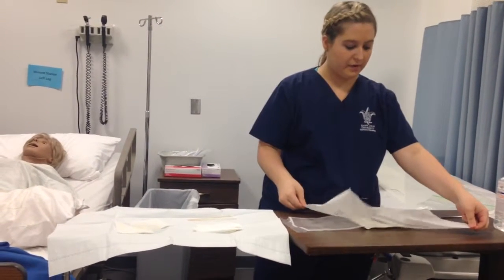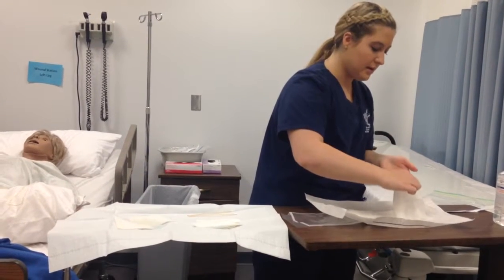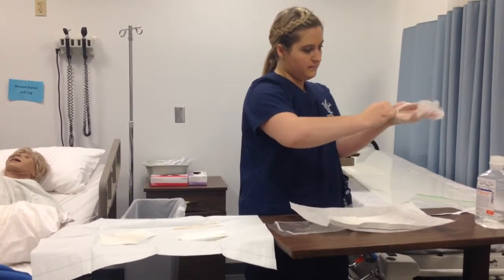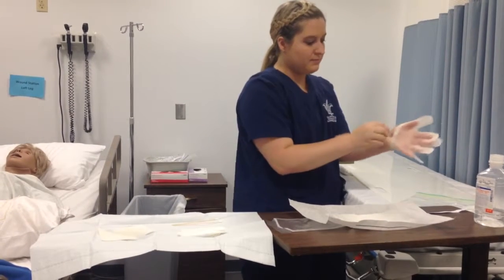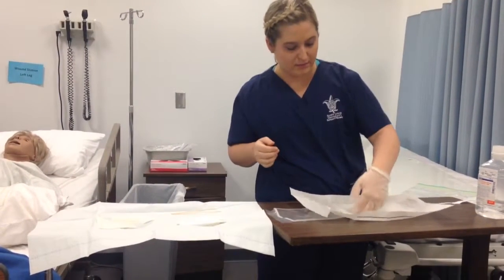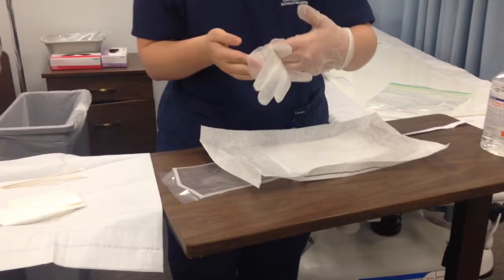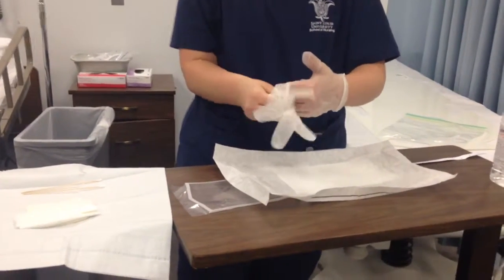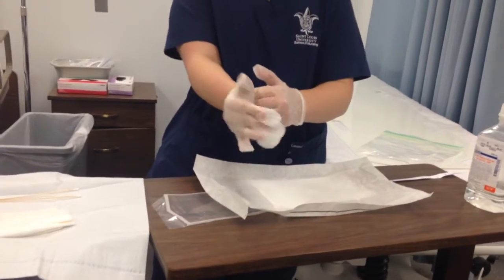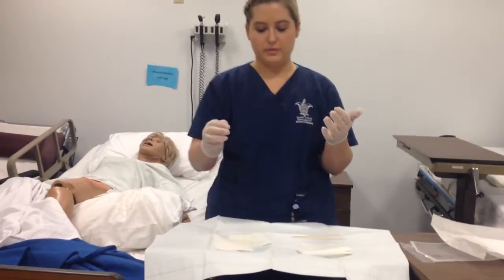So I will first put my glove on my dominant hand, and with my non-dominant hand, I will grab the outside cuff and lift it up. And always make sure my palm is facing up. Okay, and then I take my 4 fingers and put them underneath the cuff and place my non-dominant hand in the other glove. Okay, and now I'm going to clean the wound.